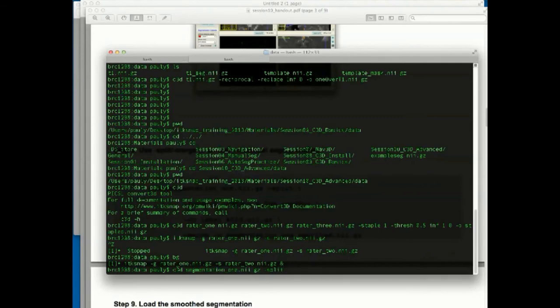What that's going to do is, to begin with, we have only one image in the stack, right? Just the segmentation 1. As soon as I say split, that's going to be replaced by 10 images because there are 10 labels in that image. So now we got 10 images. So this is an example of how you'll then use a for loop.